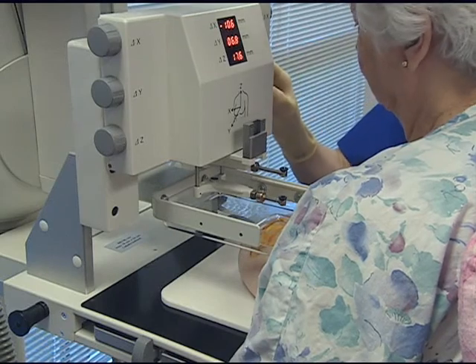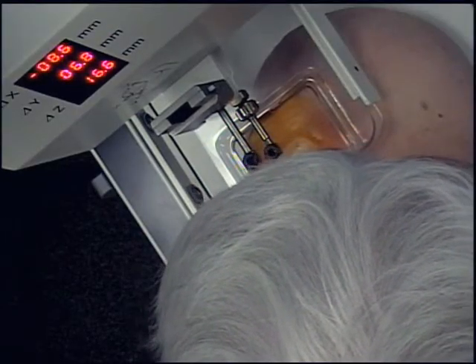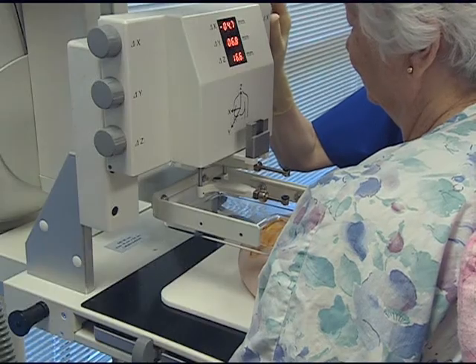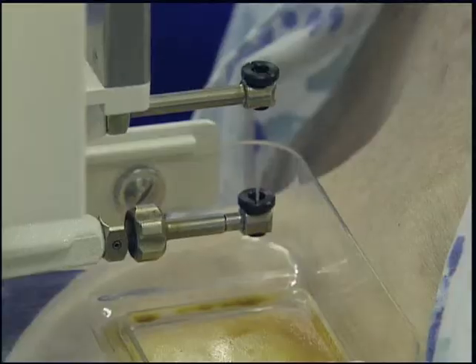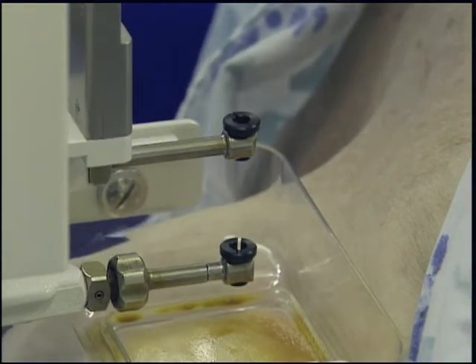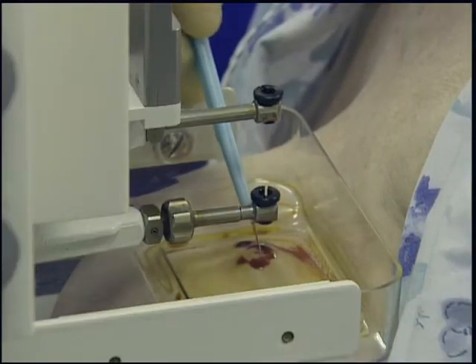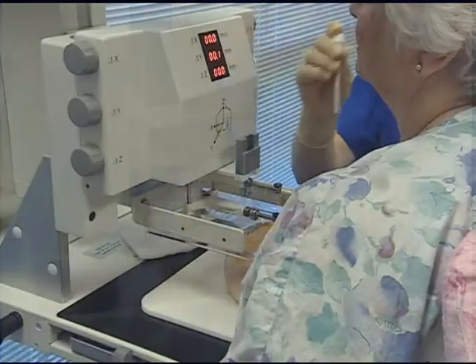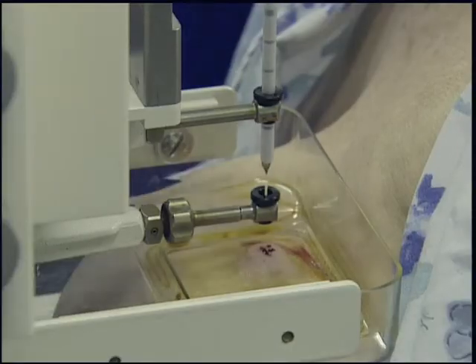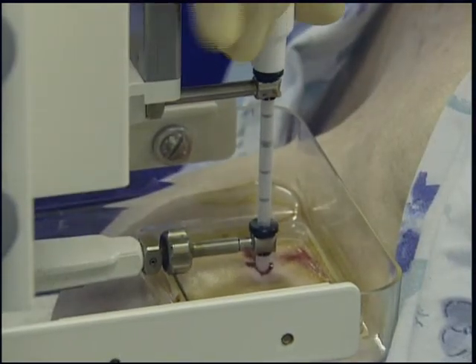We just transmitted all of the data from the device and I'm confirming the x, y, and z coordinates as we get you positioned. That way I know exactly where to put a little 2% xylocaine to numb the skin and make a tiny little incision. Now we'll put a little introducer in there — I always just loosen it up a little bit before I put it in. Make sure everything's flush.